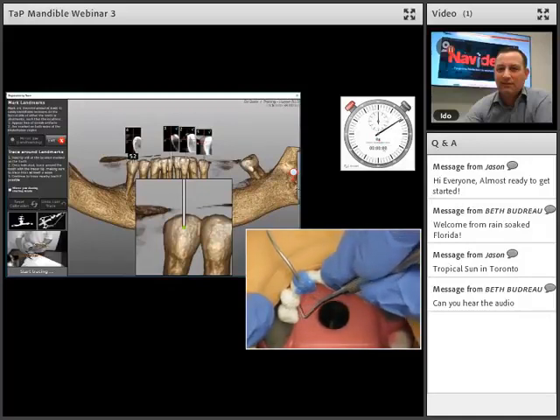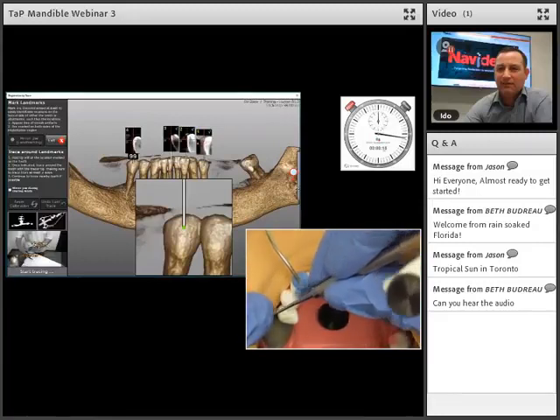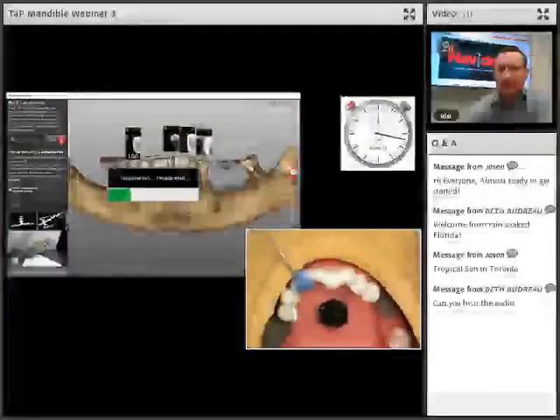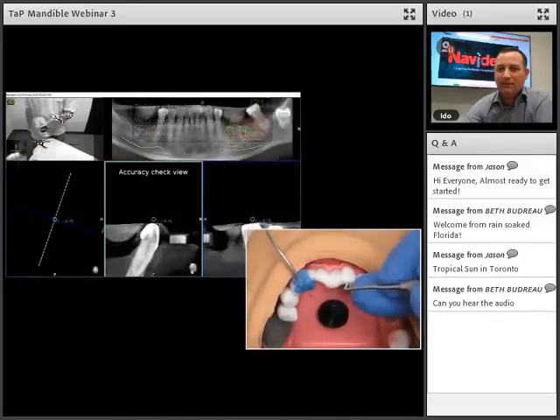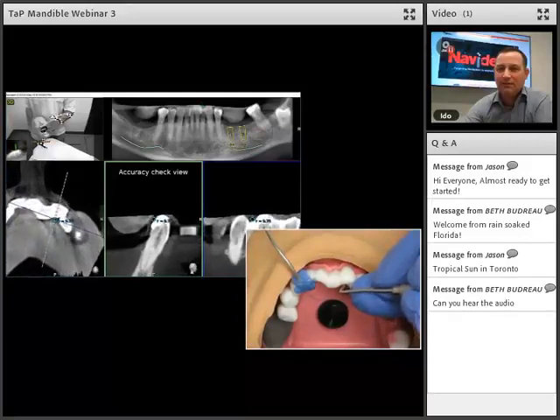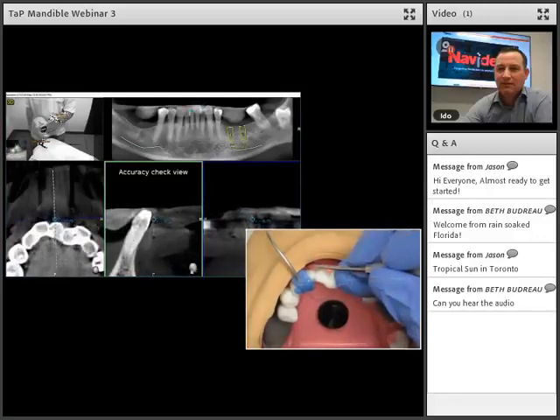We can see that an average single tracing takes about 17 seconds, so the whole tracing required for the registration of the patient's jaw with its scan would take about 1 minute. I now verify the registration's accuracy by touching with the tracer's tip on different locations on the teeth and comparing its physical location on the tooth with its virtual representation on the screen. Once accuracy has been verified, we can proceed to the surgical navigation part.